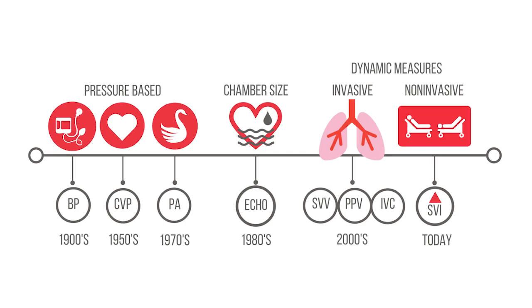In the early 2000s, a lot of work was done using respiratory-based loading of the heart to assess fluid responsiveness, right? So we have our pulse pressure variation, we have our stroke volume variation, often utilizing pulse contour technologies. Those rely on changes in the respiratory cycle to load the heart, all right? So it requires a respiratory cycle to load the heart. This actually works very well, right? But it's very difficult to implement in clinical practice because it requires our patient to be intubated, they have to have a stable rhythm, they need to be paralyzed, and that makes it really difficult to implement on our patients.